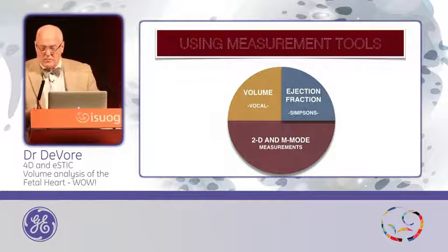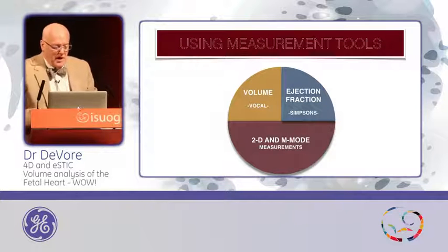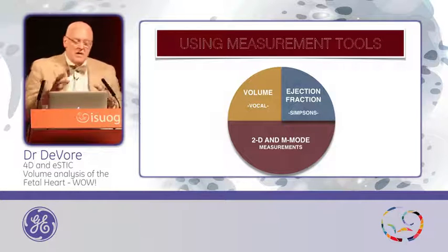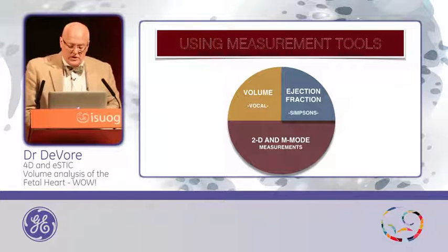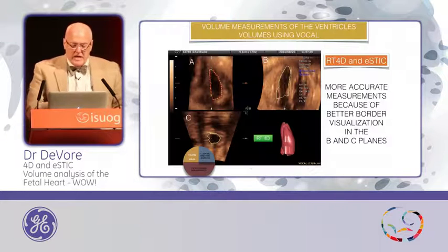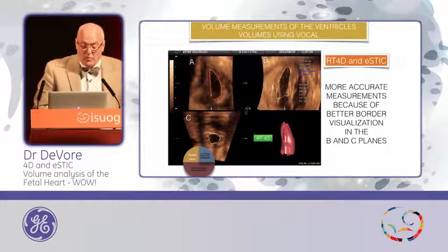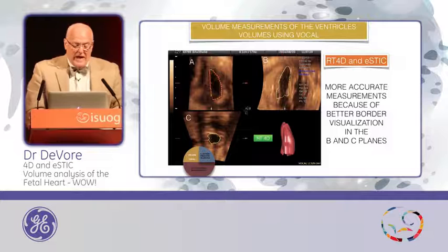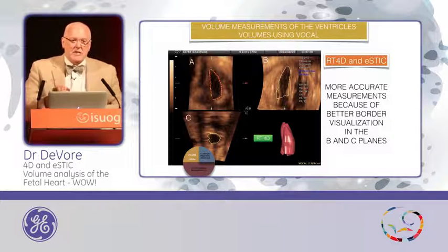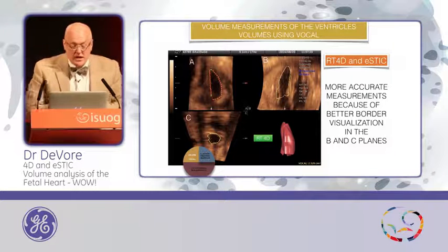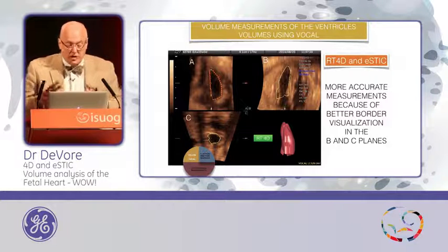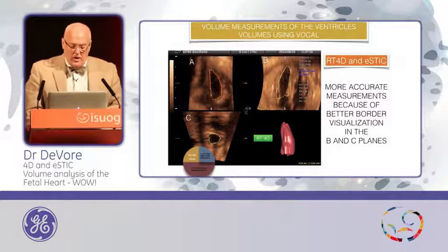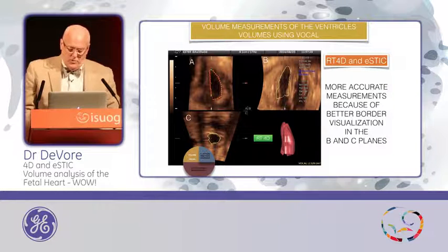In the next five minutes, I'm going to share how we apply these technologies to things we do all the time — VOCAL acquisition, Simpson's Rule for determining ejection fraction, and 2D and M-mode measurements. This is a diagram traced from a real-time 4D image of the fetal heart. Looking at the A, B, and C planes, notice how clean this tracing has been in the VOCAL determination. Our colleagues in Israel and others have published elegant work using VOCAL to determine end-diastolic and end-systolic volumes and computed cardiac output, and here we see those corresponding tracings to compute the values.